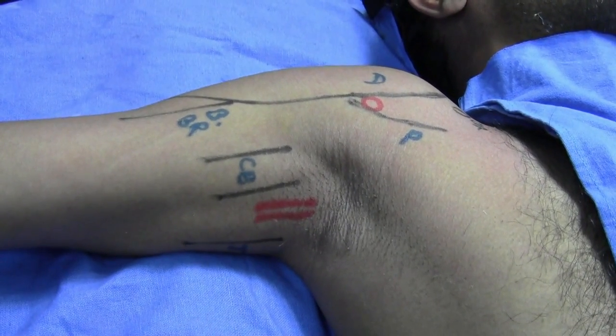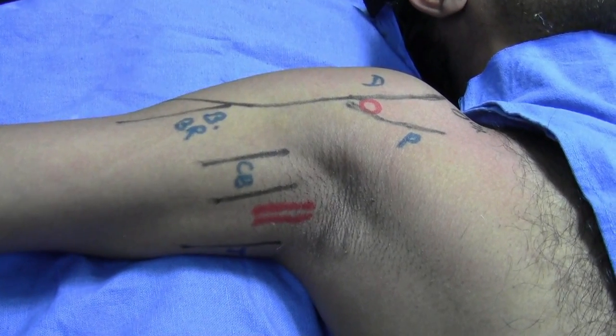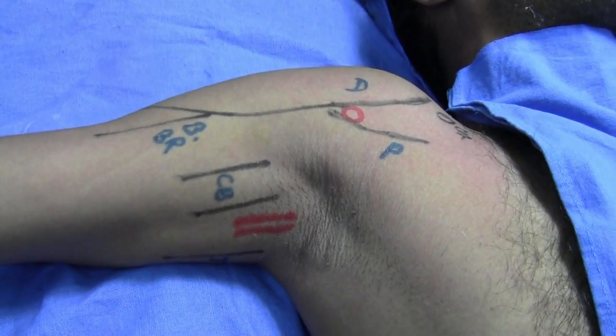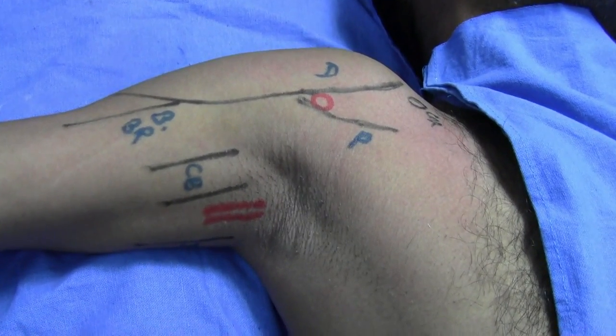This young patient has sustained a crush injury in his right index finger and I am planning to give an axillary block through the direct approach.